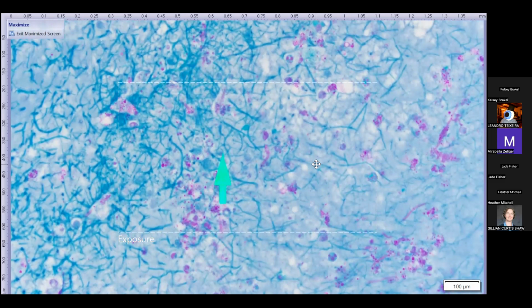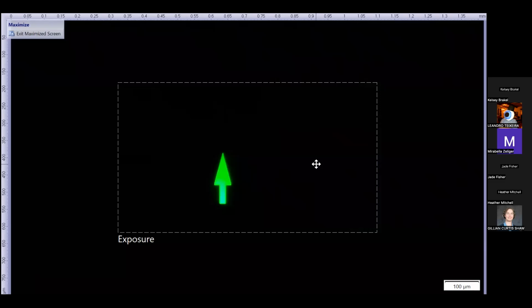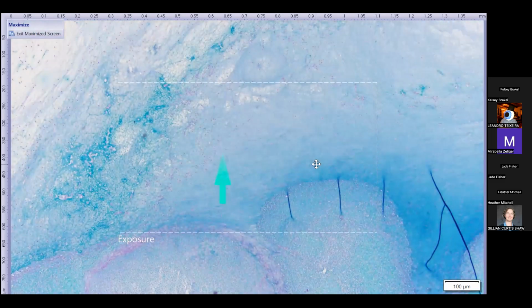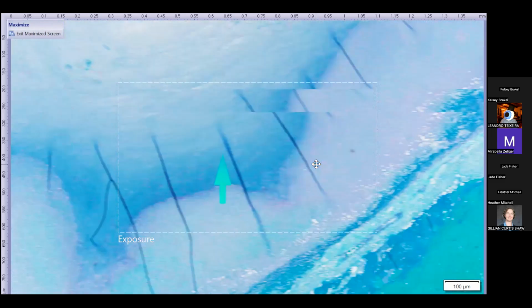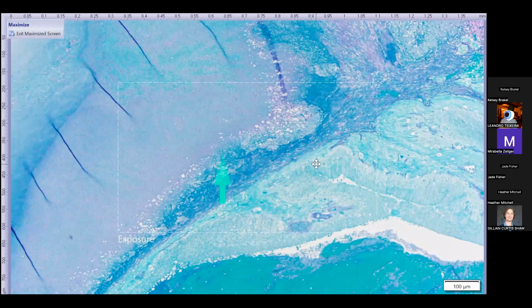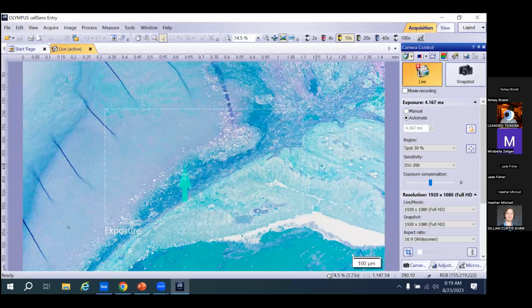So I thought that was a pretty nice contrast for how the stains differ. So we assume that the fungal hyphae arrived in the eye via blood, via the vasculature. I looked really carefully at the retinal and choroidal blood vessels here and didn't really see any convincing intravascular fungal hyphae, but that's still our assumption.